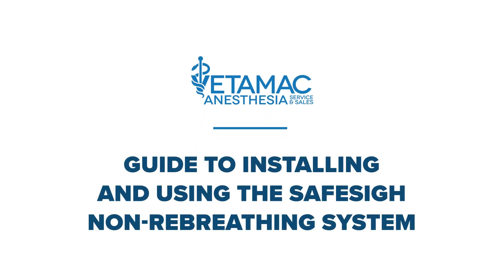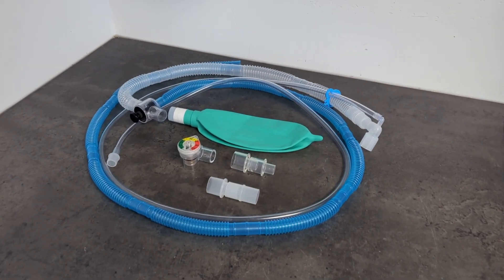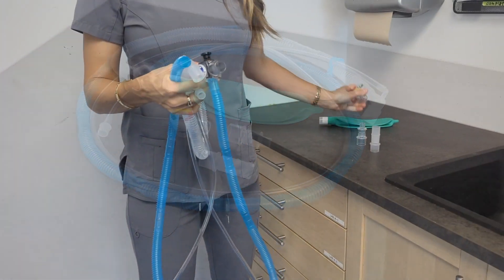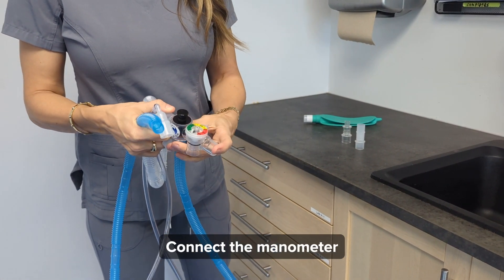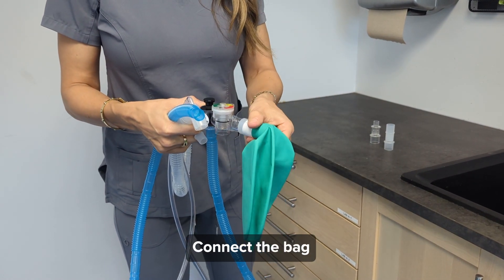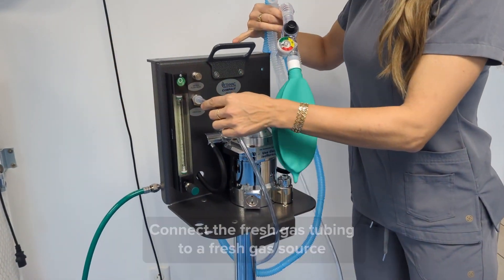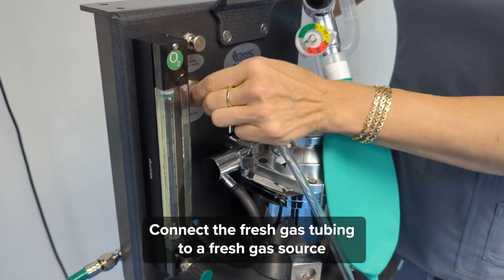Guide to installing and using the SafeSigh Non-Rebreathing System. Connect the manometer. Connect the bag. Connect the fresh gas tubing to a fresh gas source.